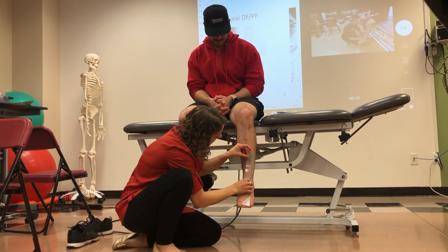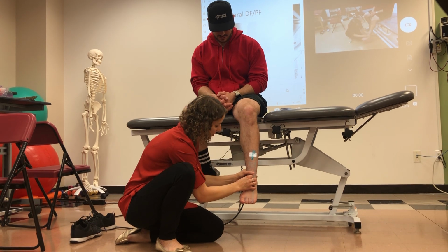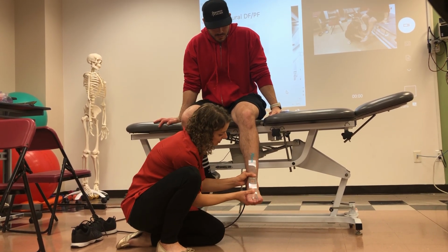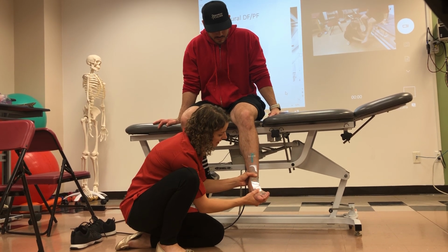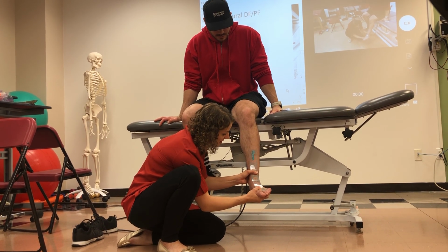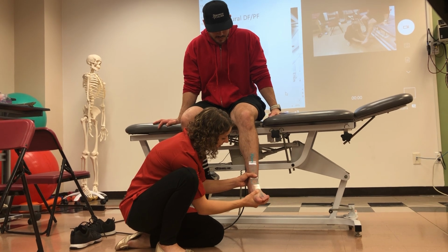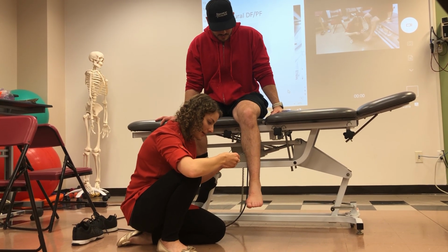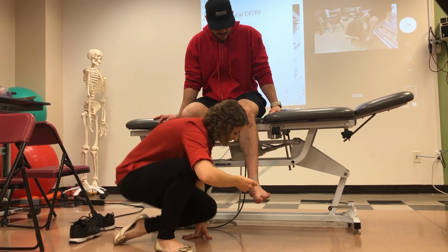So in between the malleoli, up to the tibial tuberosity, and the second metatarsal. And then again, dorsiflexion, eversion. And typically there's less eversion range of motion than inversion. And he's about 8 degrees of eversion.